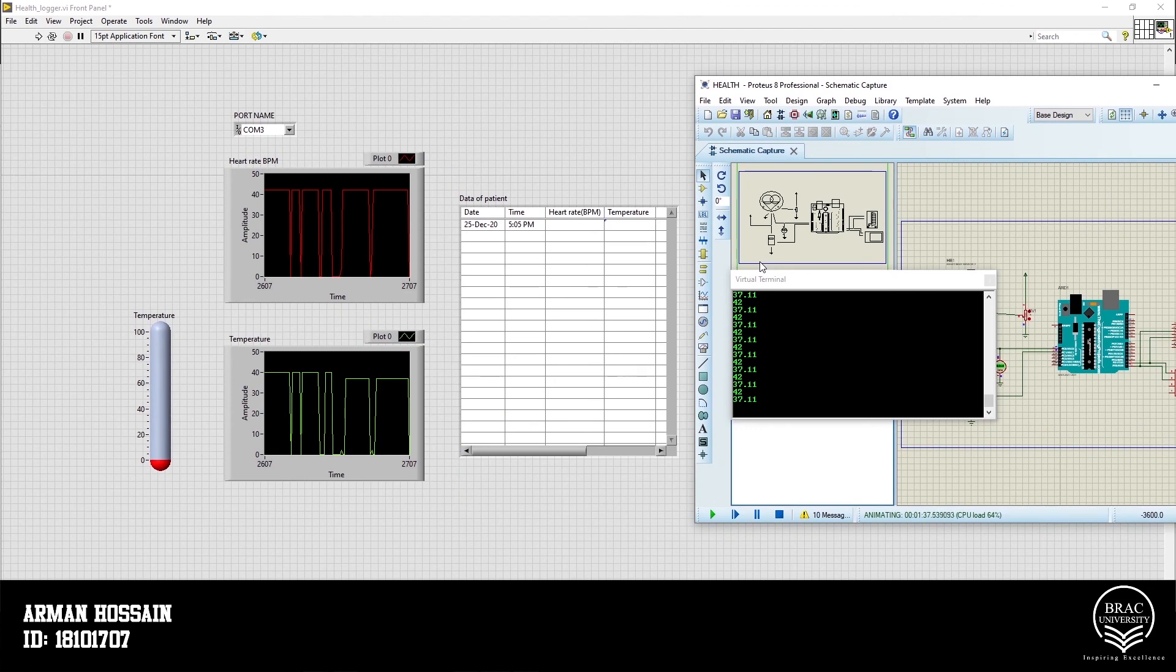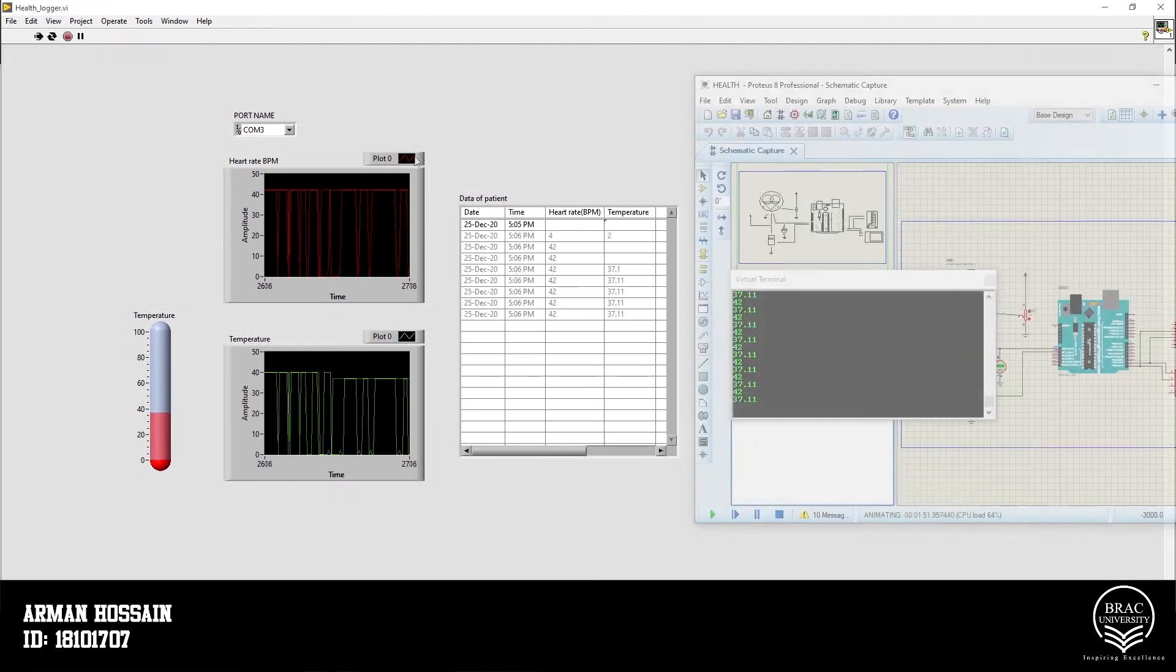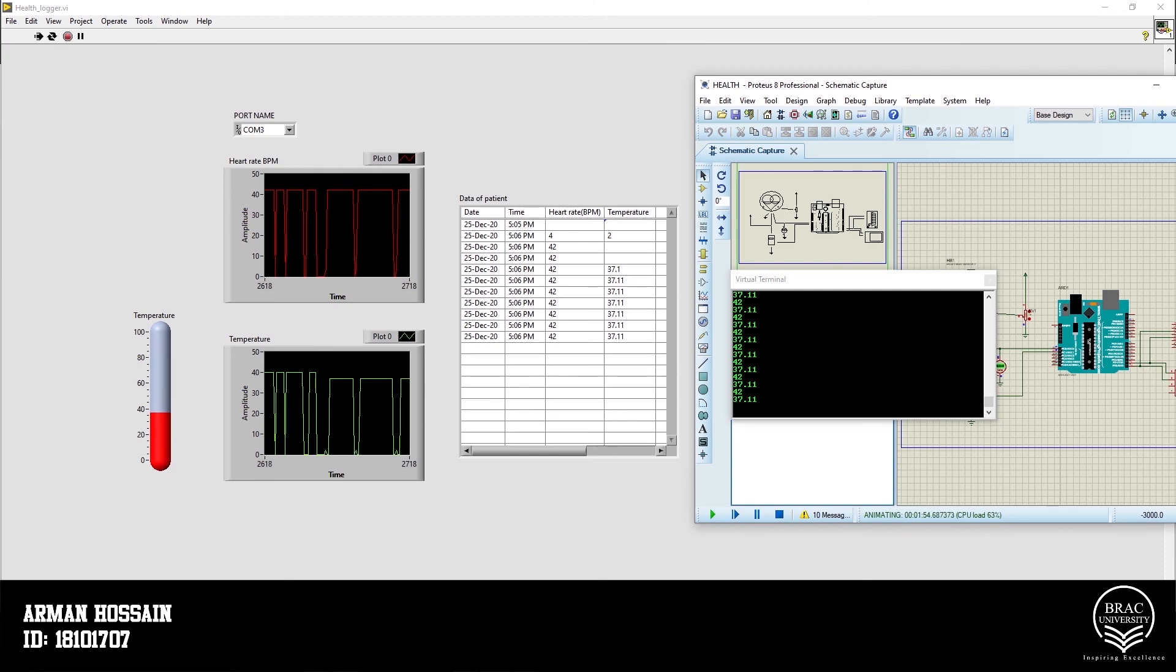Now let's turn on the LabVIEW to see the simulation. Here we can see our data is logging successfully. And that's the end of this video. Thank you so much for staying with us.